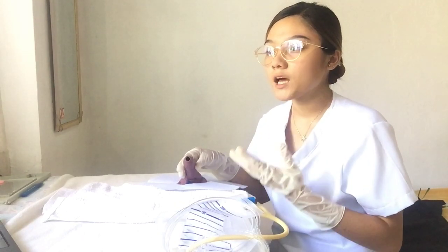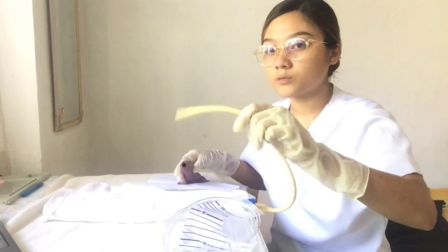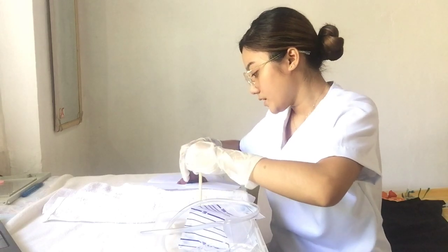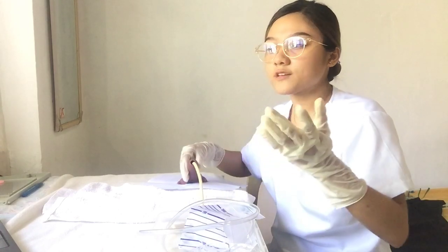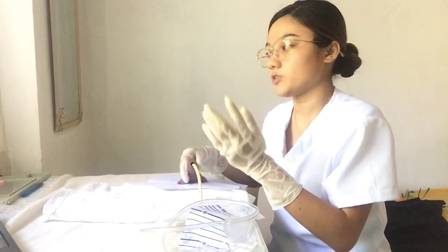For patients needing extra lubrication, the lubricant can be injected directly into the penis. Then gently insert the catheter into the urethra approximately 8 inches until urine begins to drain. Do not force the catheter if you feel resistance from the patient or if the patient complains of pain.